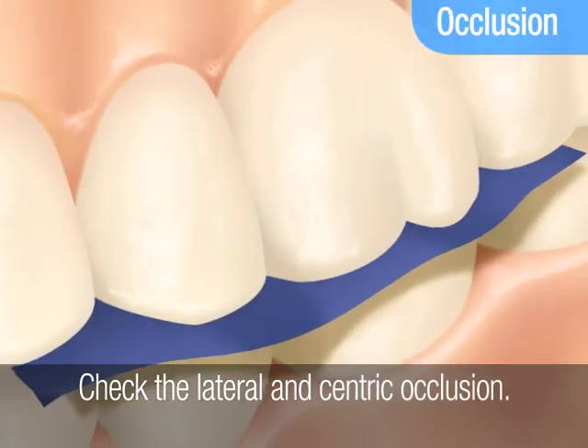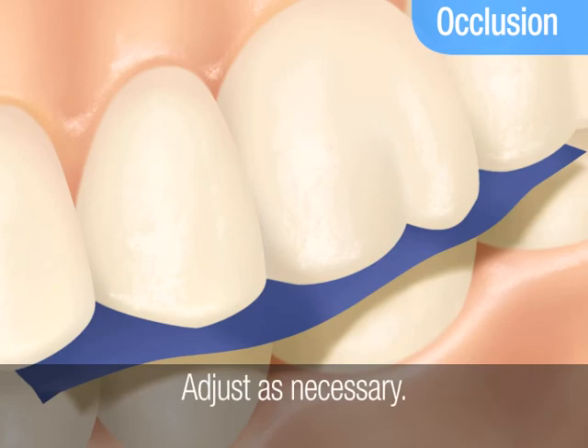Finally, check the lateral and centric occlusion and adjust the restoration as necessary.